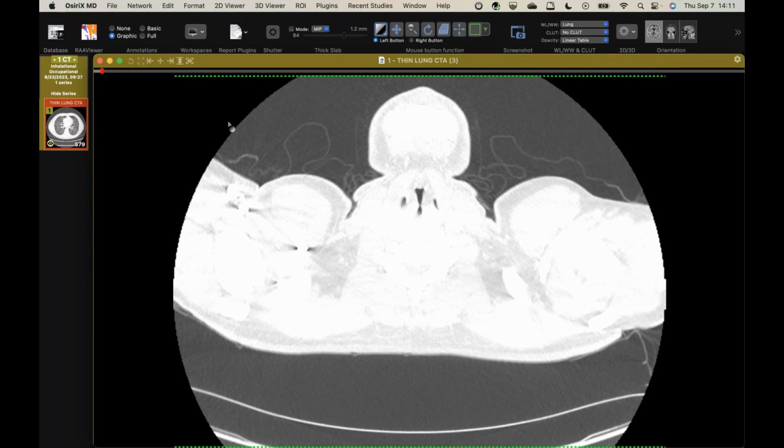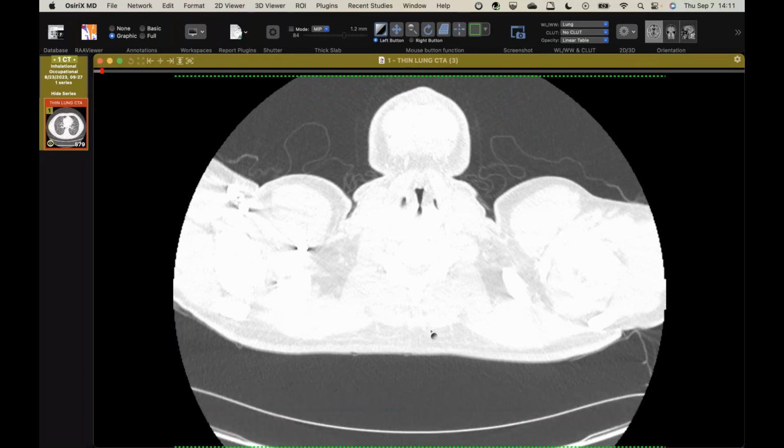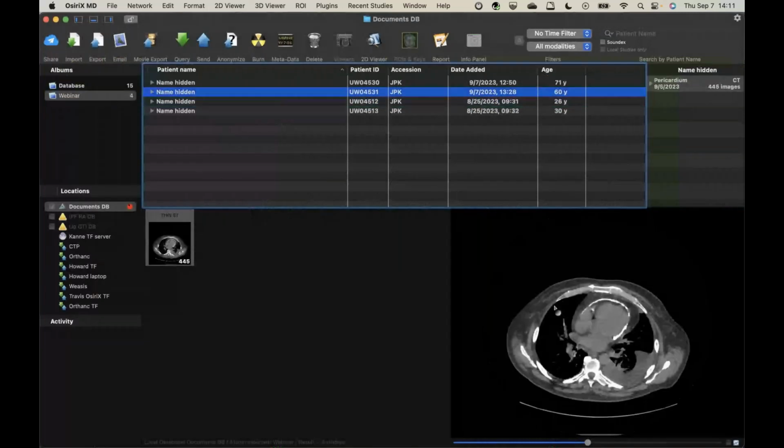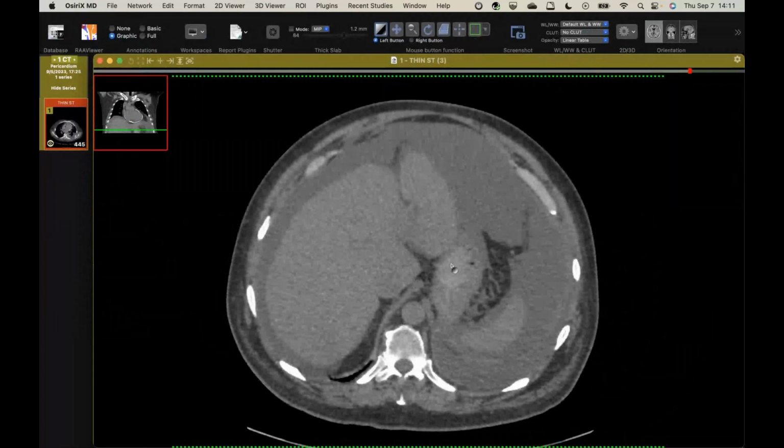All right. So this patient is a younger patient who had ascites too. So did they have cirrhosis from their constriction or just, not yet? Not yet. It was a relatively new diagnosis. Yeah, you can see the ascites there.